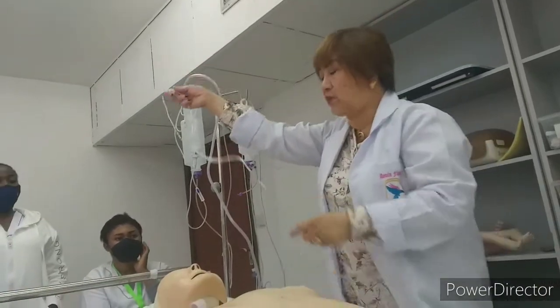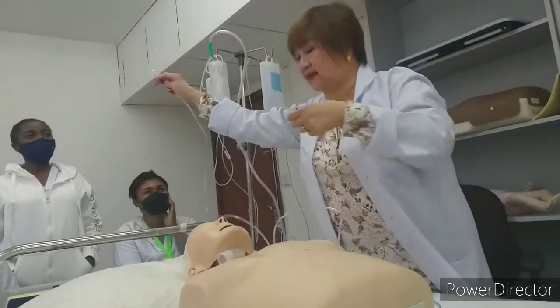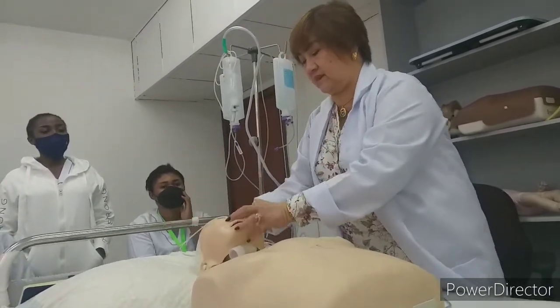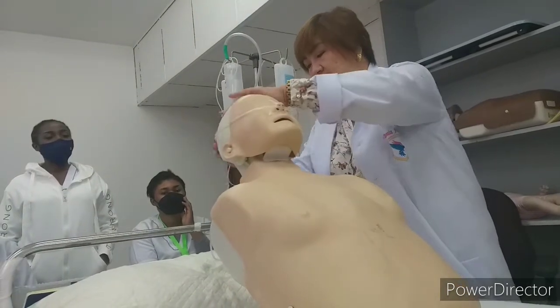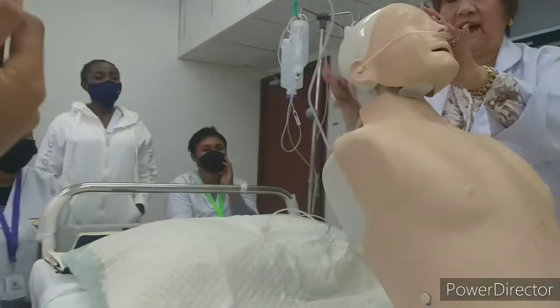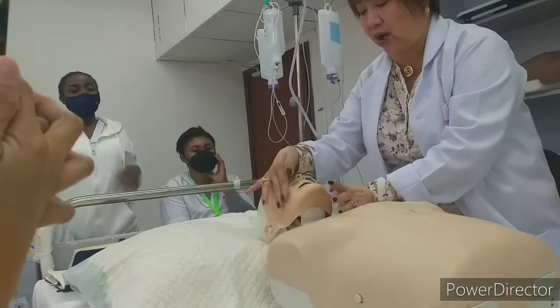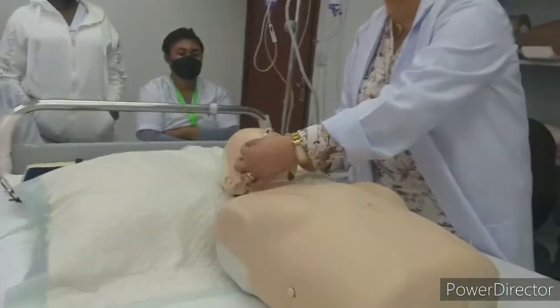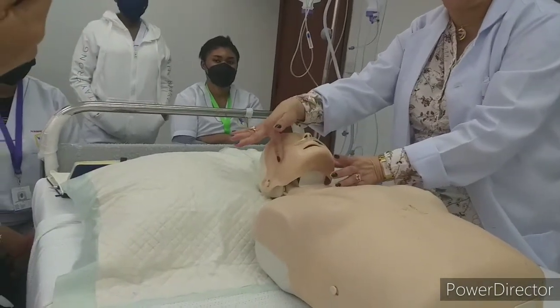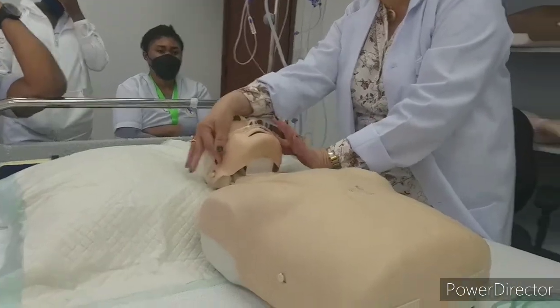Okay? So, same way, attach it, connect it, set to 1, and let the patient, okay, fix it at the back, over the ear. If this one is rolling, we will put a small piece of plaster here to keep it secured. Okay, so it will not be rolling like this. Okay, so keep it here.